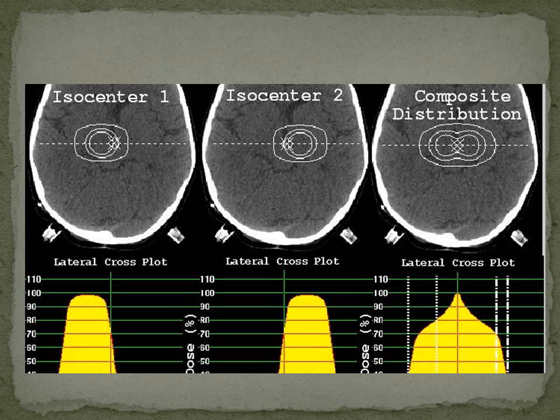But what happens in that normalization is these curves are shifted, and you'll see that when we actually go to multiple isocenters, we go to the 70% isodose line for prescription. But it's really the same as the 80. It's just a normalization issue because we have the computer set to always find the maximum dose in the patient and normalize it to maximum dose. And we do that because we don't want to be fooled.